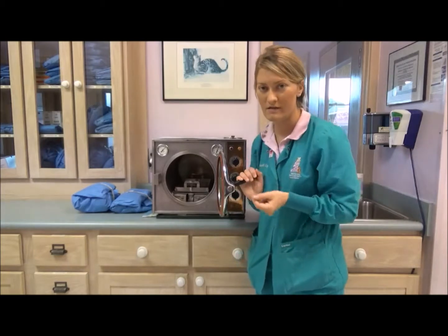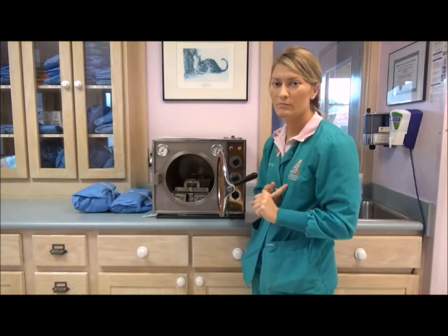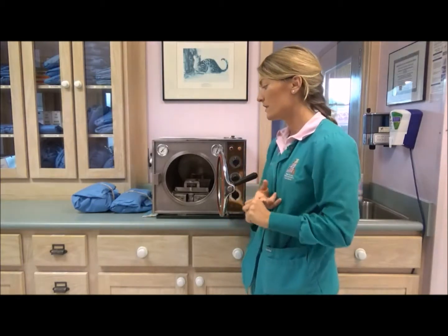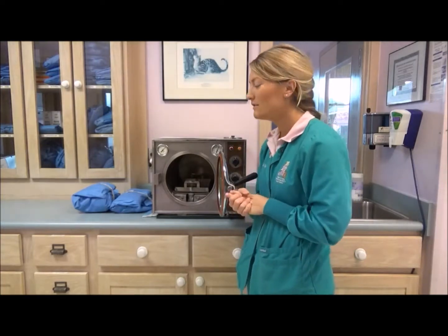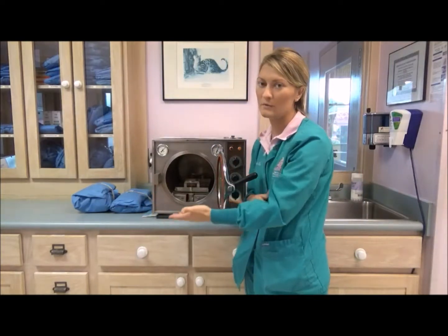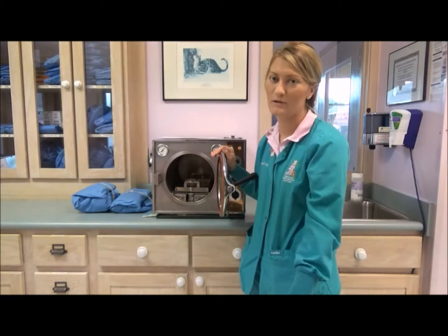There's 3 key things you want to make sure you follow when handling an autoclave. First, you want to properly operate the machine. You also want to make sure that you follow proper pack preparation, and you also want to properly load the machine. So I've already shown how to pack items properly, and it's always a good idea to pack them in a designated pack prepping area.